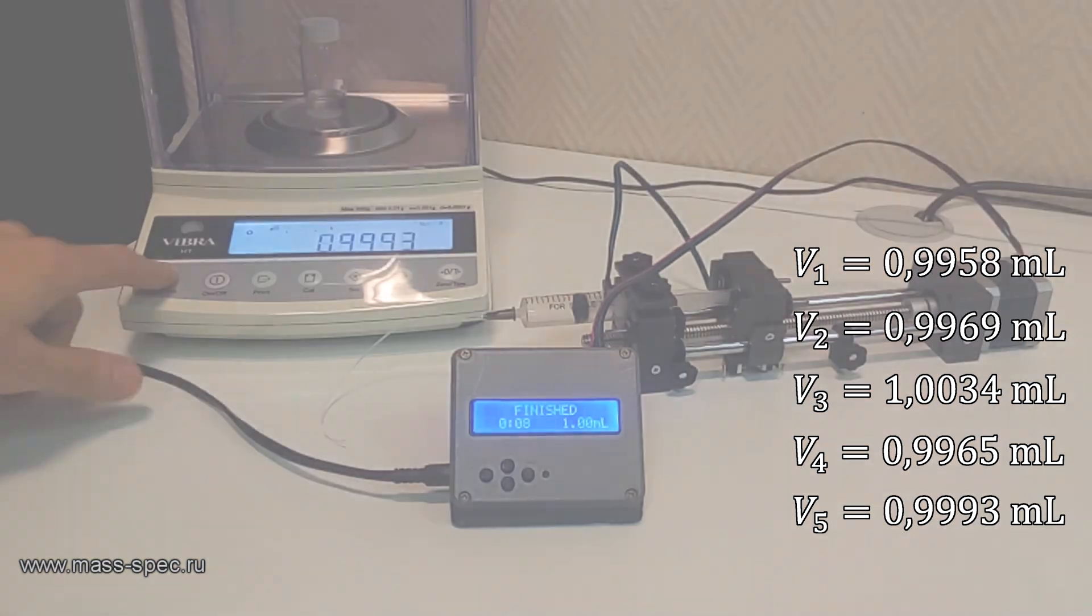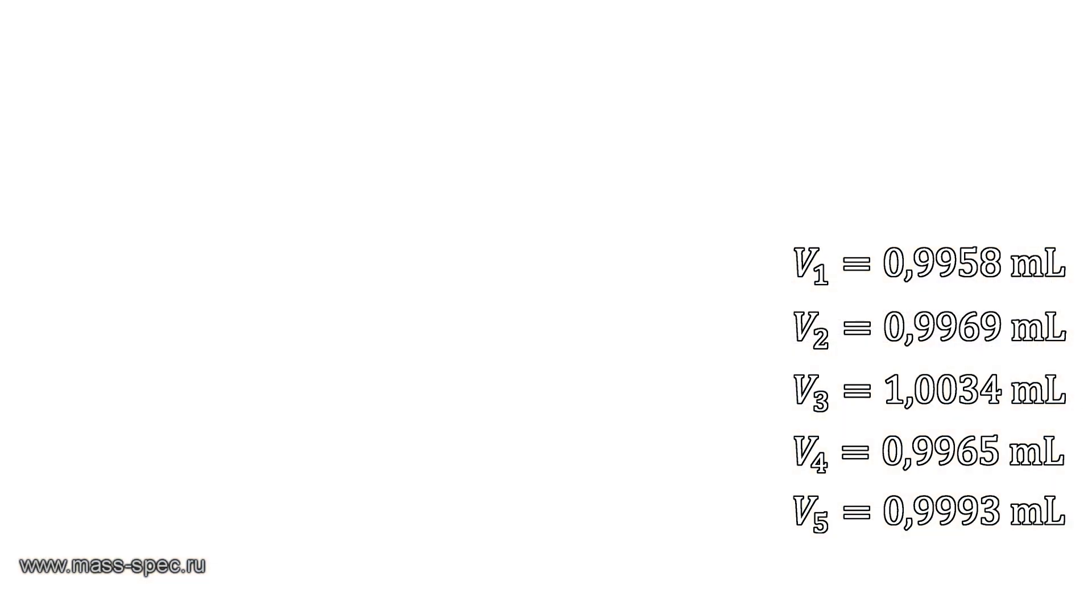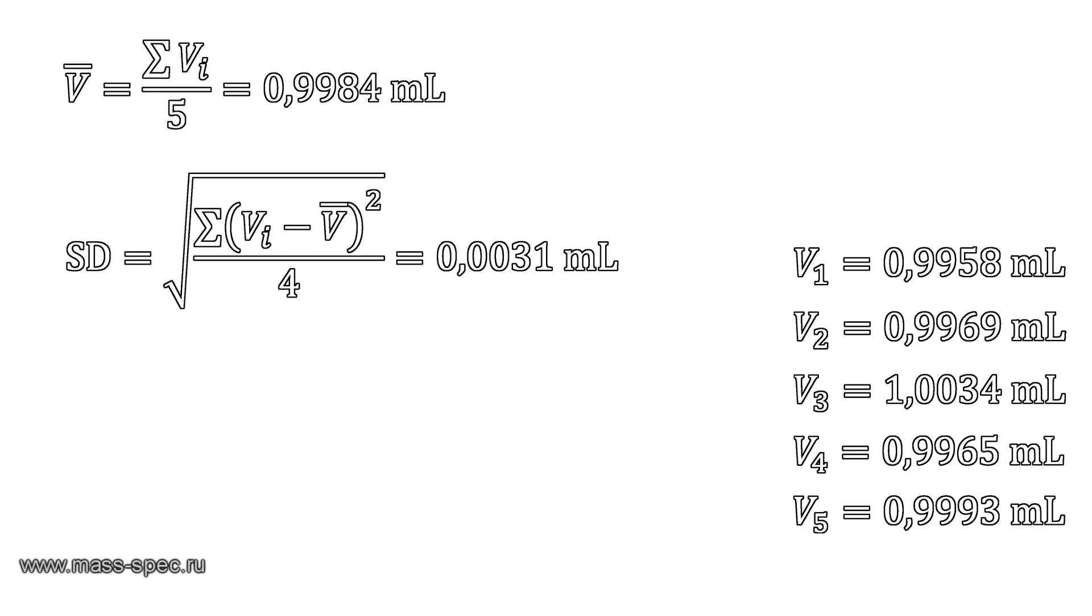All measured values are shown on the screen. It is easy to calculate the average value and standard deviation.